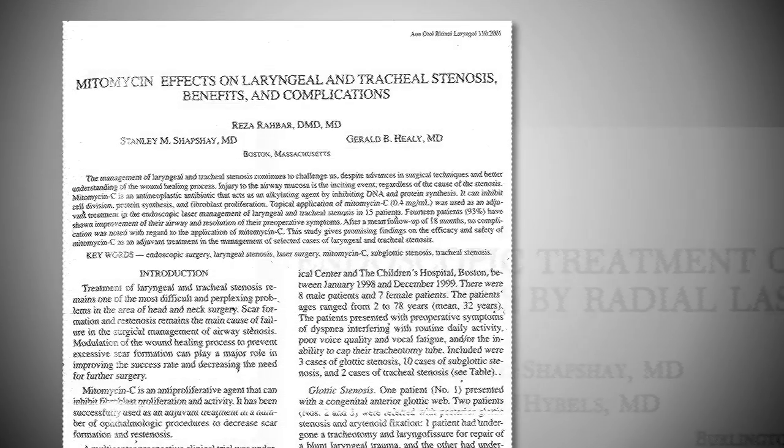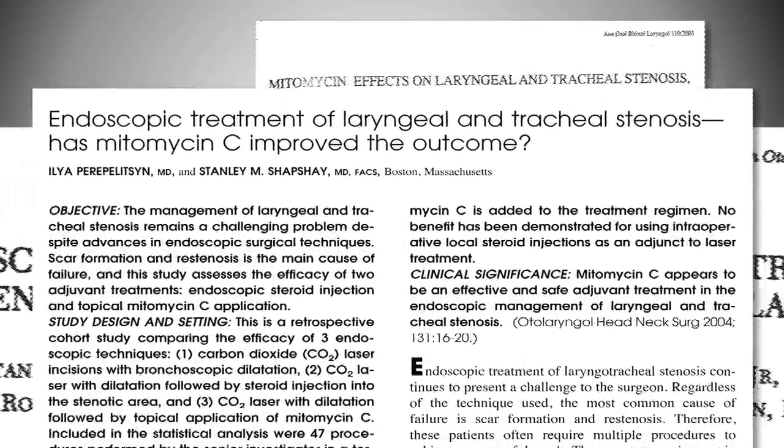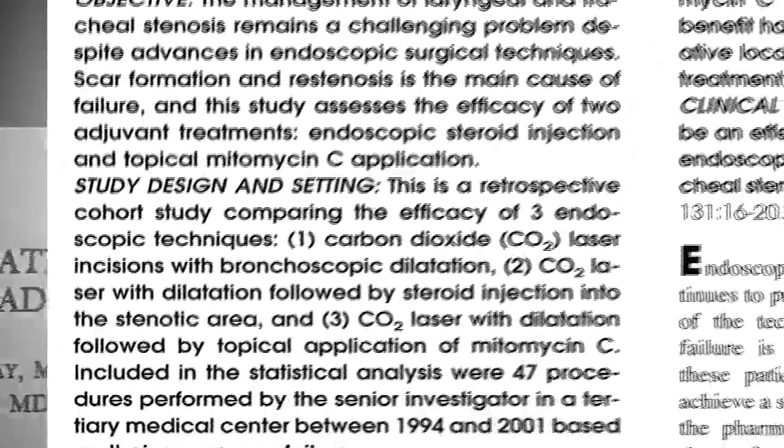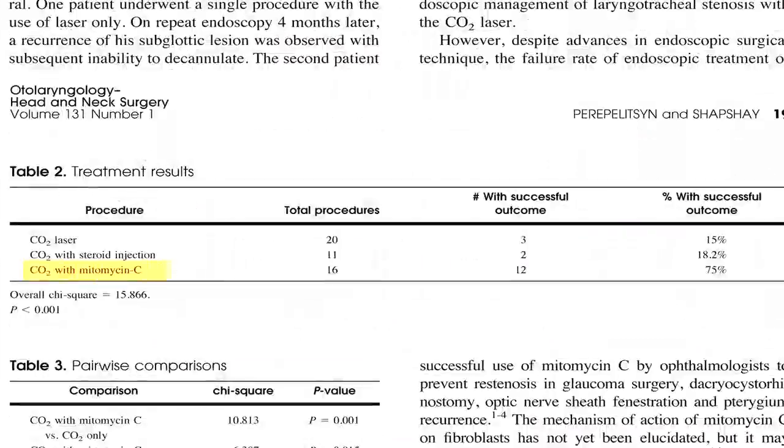We did a study a number of years ago where we looked retrospectively, of course, at a series of patients that we did laser incision and dilation, laser incision, dilation, and steroid injection, laser incision, dilation, and mitomycin C, and there was certainly a significant improvement in our outcome with all three modalities of laser incision, dilation, and mitomycin C.